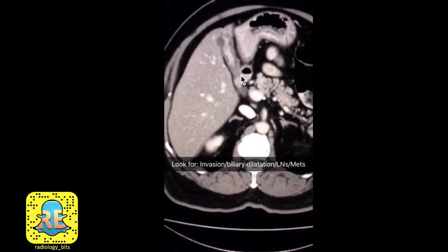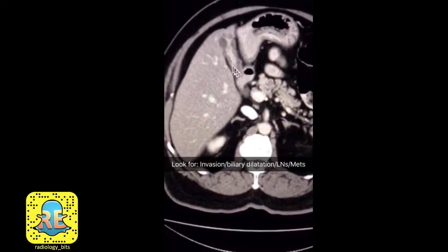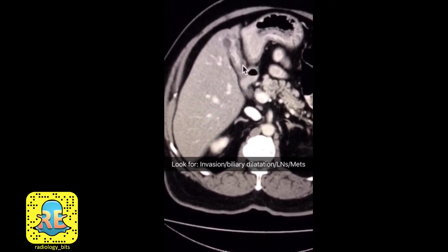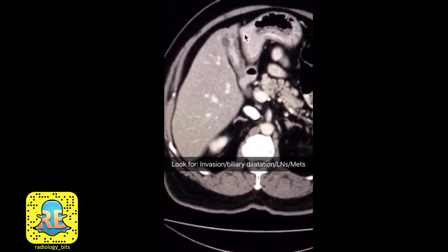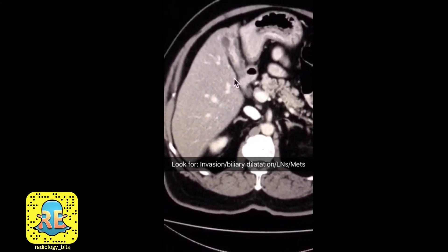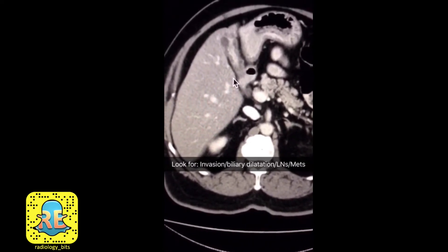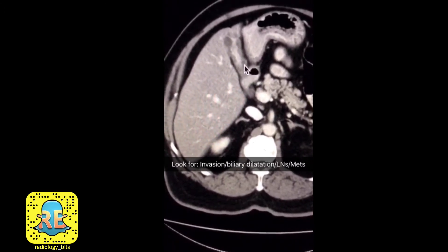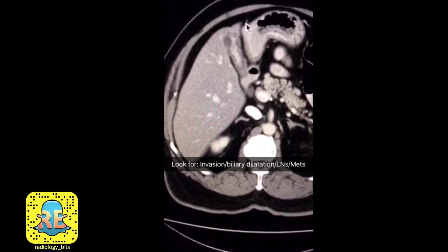Gallbladder carcinoma could present as a polyp, could be focal or diffuse thickening, or may be an invasive large mass at the region of the gallbladder fossa. An important negative to note here: the abnormality is confined to the wall of the gallbladder and the gallbladder fossa.